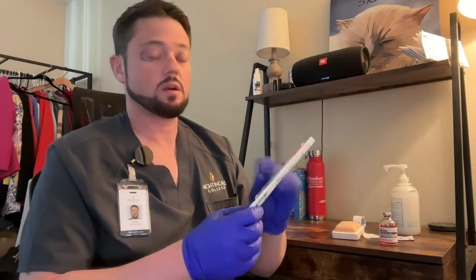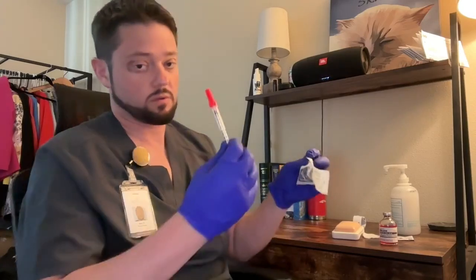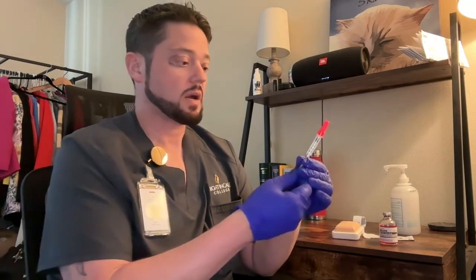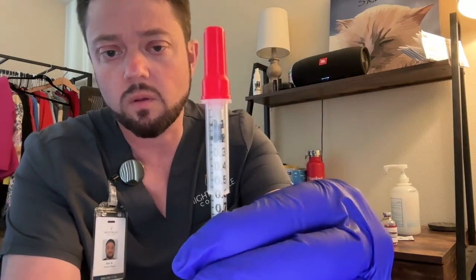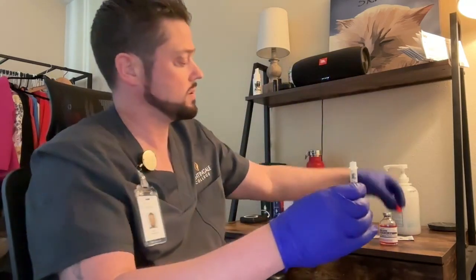I'm going to then take the tuberculin syringe and open the package. I'm going to remove my tuberculin syringe. I want to notice the point where we're going to draw the medication, which is going to be 0.1 mLs. I'm going to pull back on the plunger until I am at 0.1 mLs. So if you can see, at 0.1, we're going to go ahead and remove the cap.